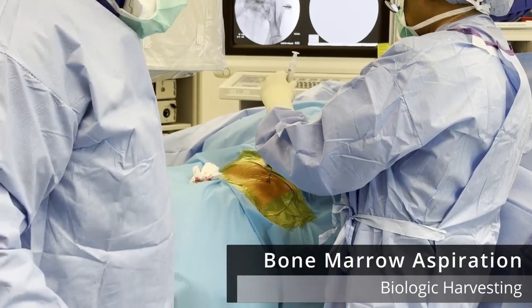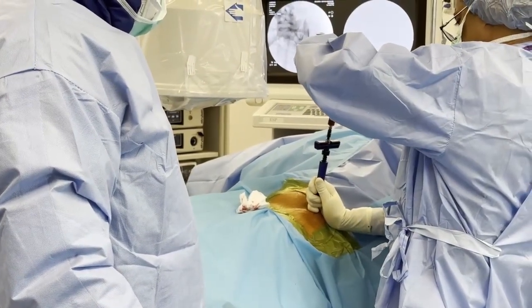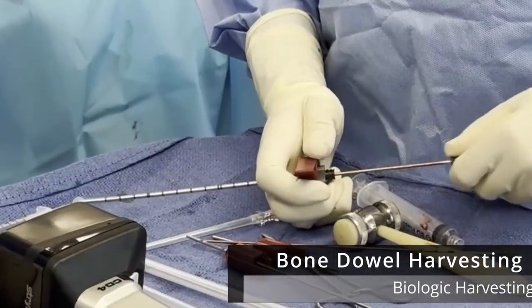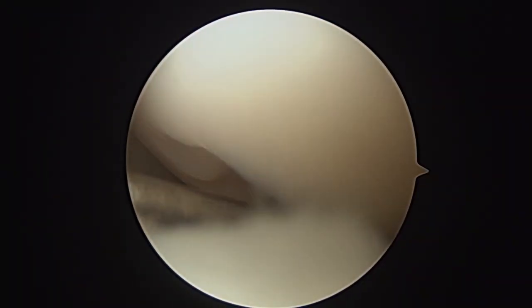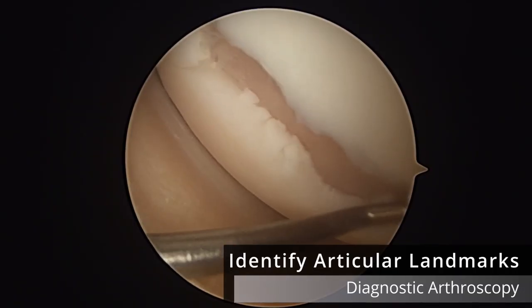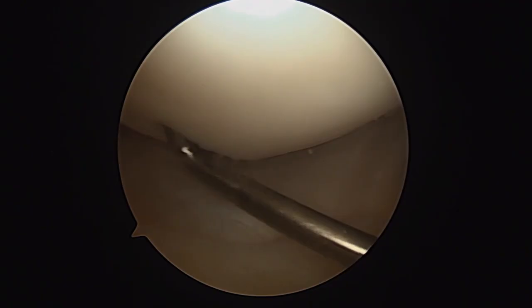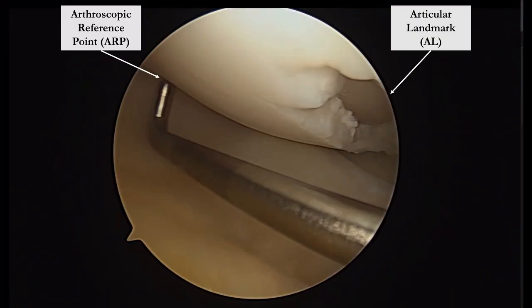Surgery begins with harvesting the biologics. We generally use bone marrow aspirate with DBM or graft from the anterior iliac crest, as this allows the procedure to be done with the patient supine and not having to change position for the arthroscopic surgery. Arthroscopy is then performed, addressing any intra-articular pathology, such as meniscal tears or chondral lesions. Attention is paid to anatomic landmarks which help reference the position of the bone marrow lesions, such as chondral lesions. The arthroscopic reference point is then identified based on the template, which may or may not coincide with chondral lesions.